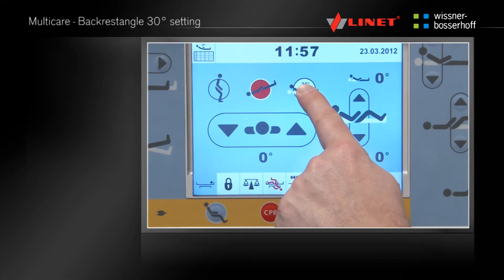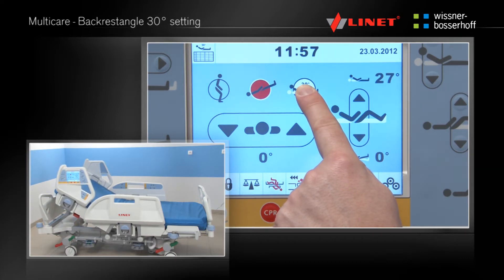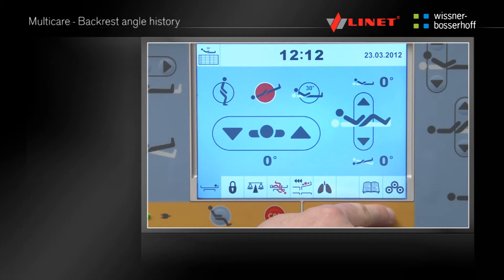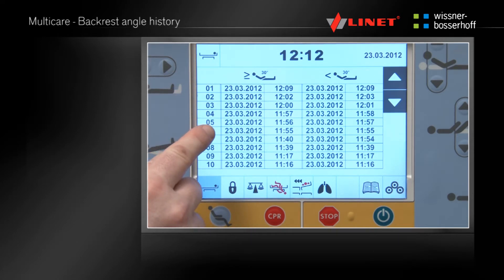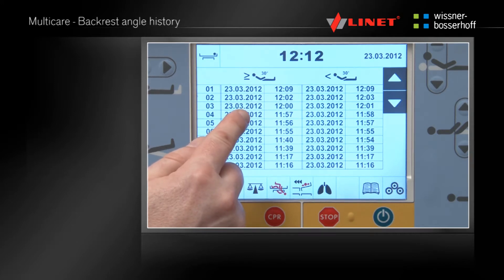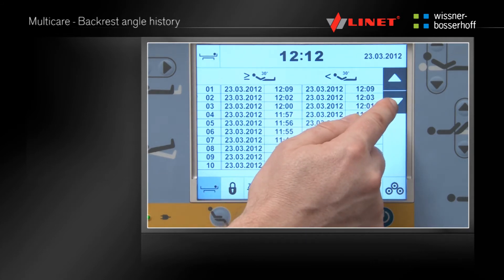Activate the function by pressing the Go button. Press and hold the function button until the backrest angle indicates 30 degrees — the backrest will be positioned to exactly 30 degrees. The backrest angle history is displayed by pressing the respective button. In the left column, information will show when the backrest angle was at 30 degrees or greater, and in the right column, information will show when the backrest angle was less than 30 degrees. The history can be accessed using arrows located on the right side of the menu. Press the Bed Icon button to return to the main menu.